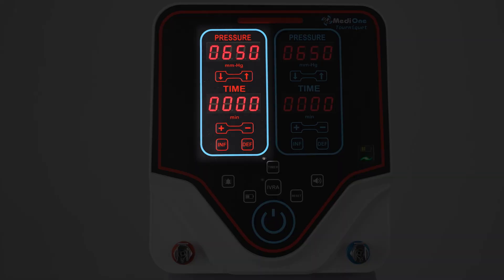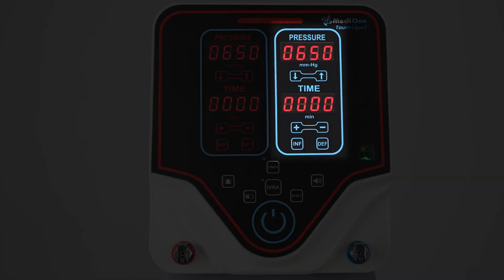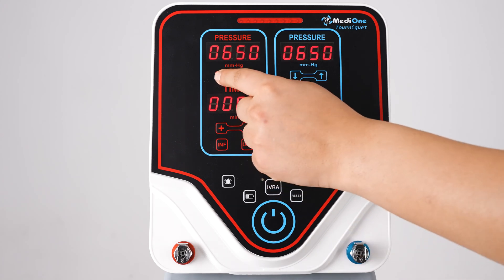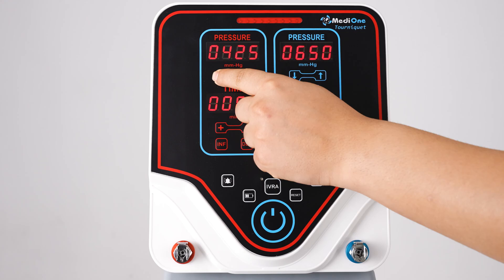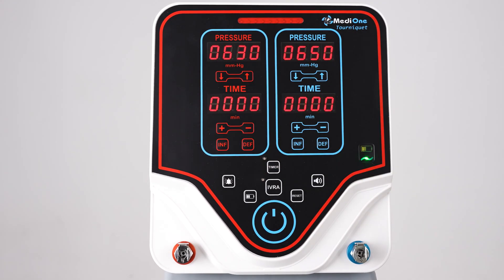The proximal part is colored red and the distal part is colored blue. The pressure gauge is located at the top of the screen. The pressure range of the device is between 20 and 650 mmHg, and the amount of increase is 5 mmHg.